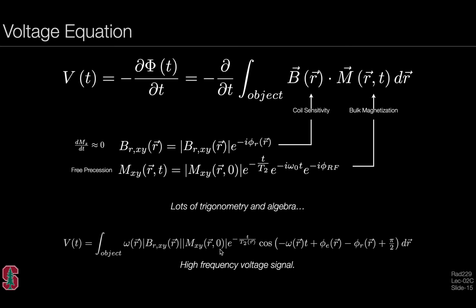We have the initial state of the transverse magnetization just immediately before we're trying to detect the magnetization, but it's of course decaying as a function of T2, it's transverse magnetization. And then there's some additional phase terms here that depend on the local Larmor frequency, which can vary because of gradients, some excitation phase, some receiver phase, and then there's some constant terms that fall out of this as well. So again, good to recognize the terms, not terribly critical to memorize an expression like this.